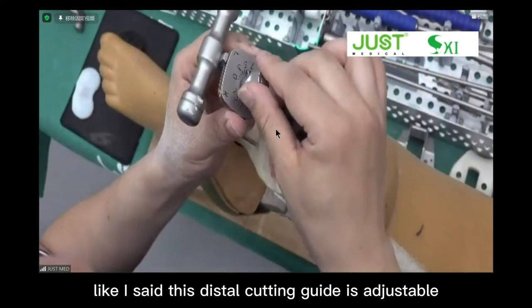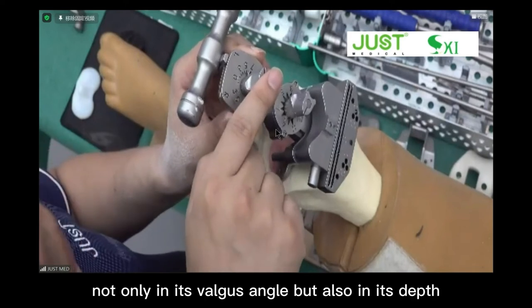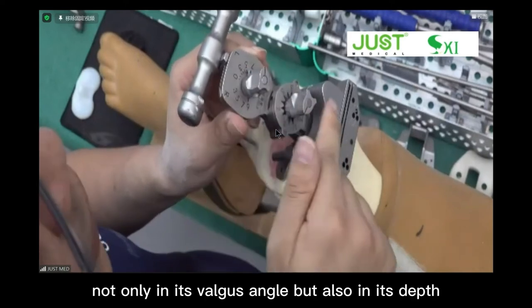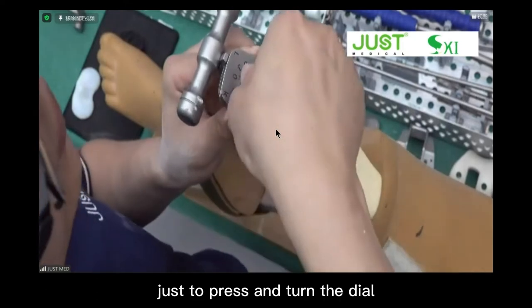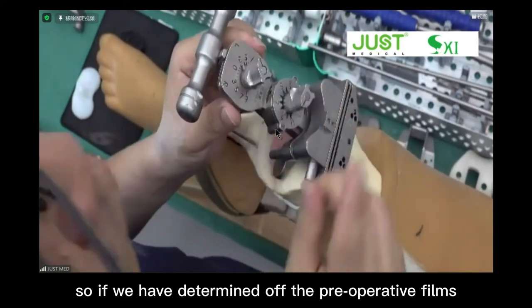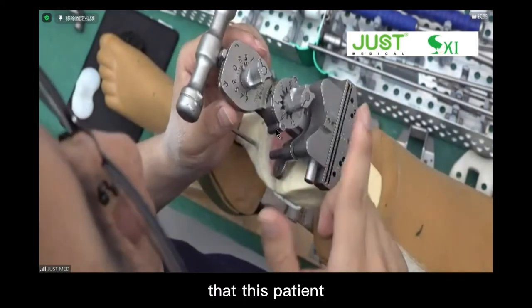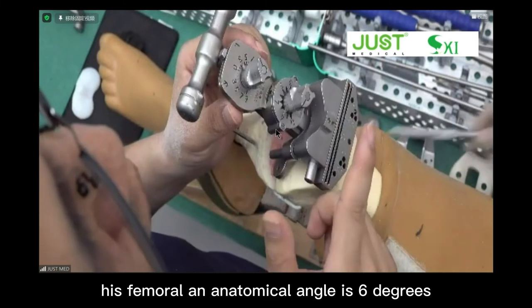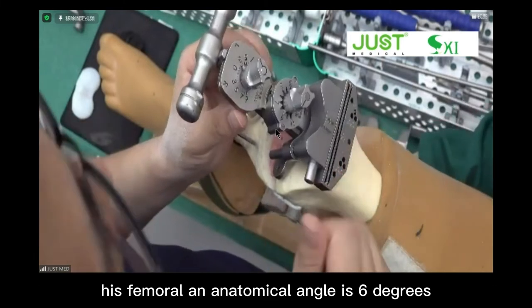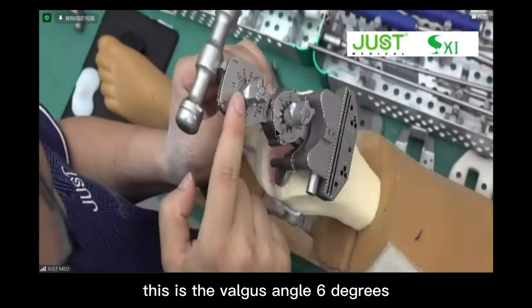Like I said, this distal cutting guide is adjustable not only in its valgus angle, but also in its depth. Just press and turn a dial. If we have determined off the preoperative films that this patient's femoral anatomic angle is 6, we just choose 6 here. This is a valgus angle, 6.